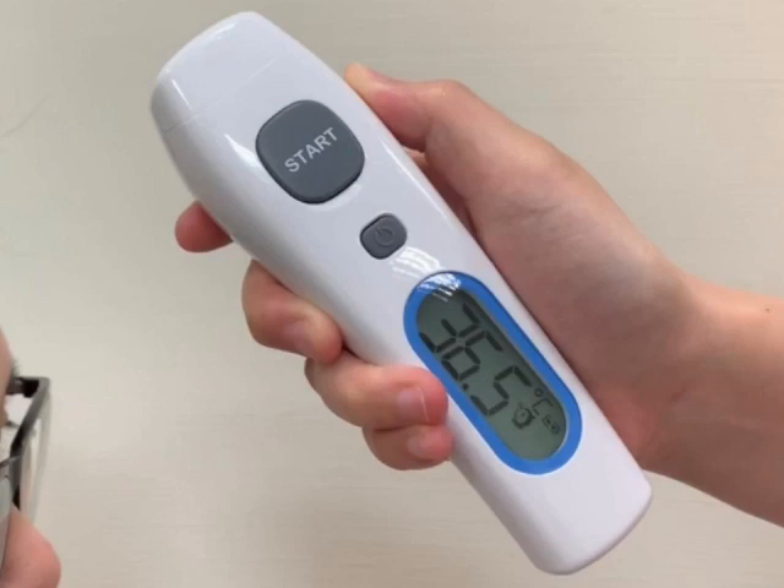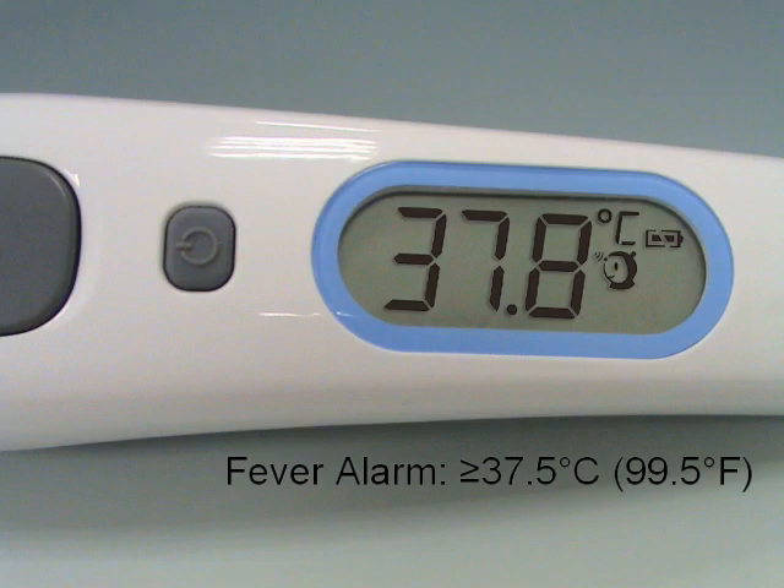After each forehead measurement, wait for the forehead icon to start flashing and the blue LED backlight to disappear before taking the next measurement. If the thermometer detects a temperature greater than 37.5 degrees Celsius or 99.5 degrees Fahrenheit in forehead mode, three short beeps will follow one long beep to warn the user of potential fever.